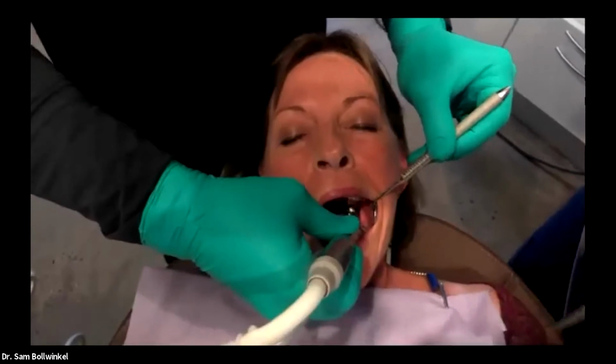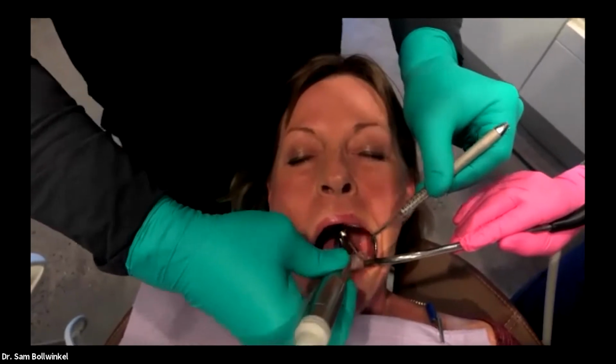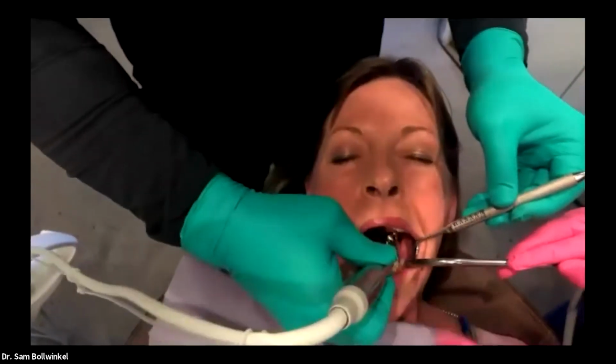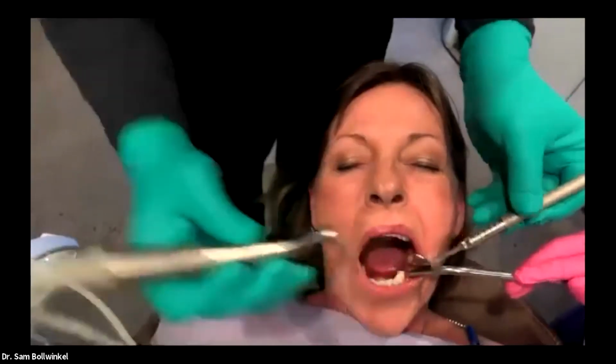We're going to just do some suction there real quick. Just go ahead and take that out. I'm going to go back over that. So what we're doing with our tissue punch is just scoring the osseous there for our patient.